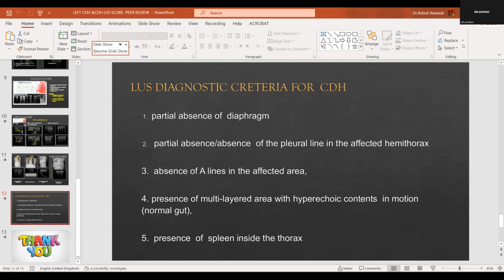Can I go to the second one? Any question here? Any question, folks? Please go ahead, sir. I will share now. The second case is here, because this has a good image.